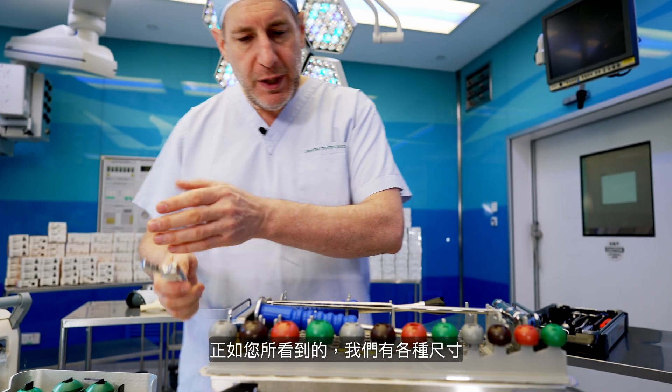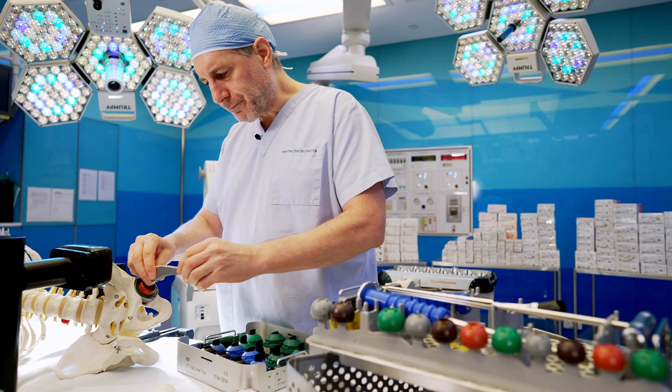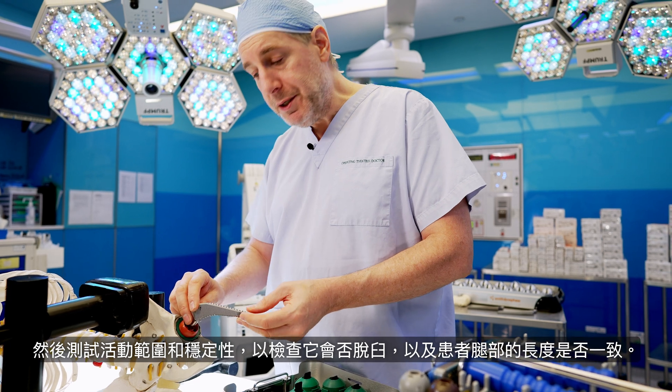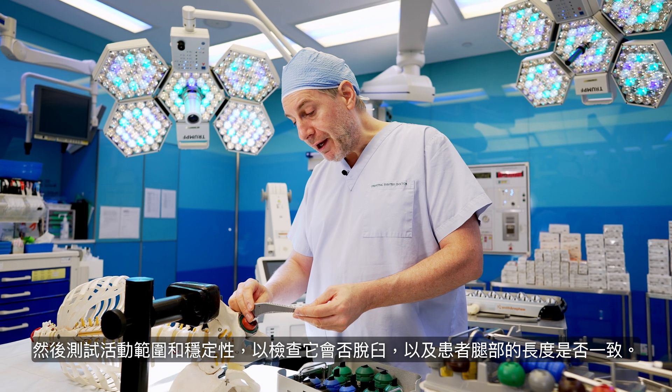As you can see, we have a whole range of them. And then we test the range of motion and stability to check it doesn't dislocate and that the patient's leg is the correct length.